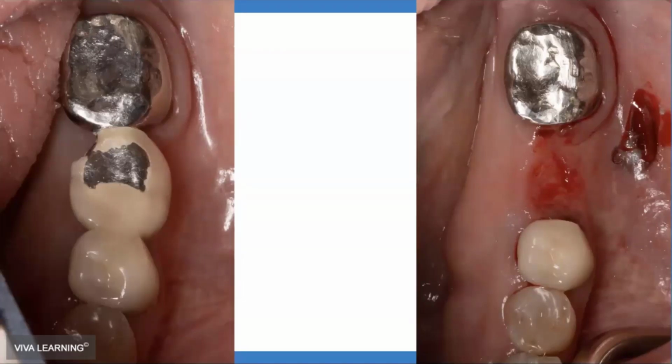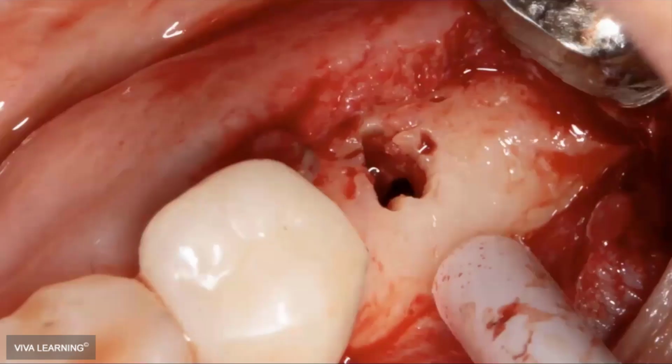The assistant, we had a little bit of a snafu with retraction there, so I did lacerate the patient's gums there, as you see on the right, but they healed from that. But when we do an incision on a case like this, I like to make it between those lingual line angles there, and then just pull all that full thickness flap to the buccal. That almost always is enough of a flap to see the bone level here, because I was doing it guided, but I was also just using a laser, so I wanted better visibility for the surgery.